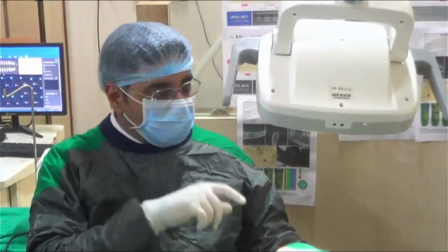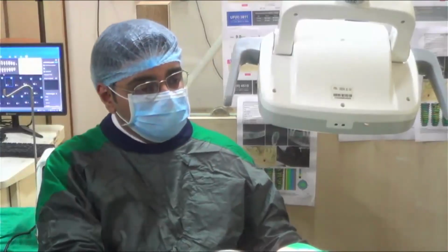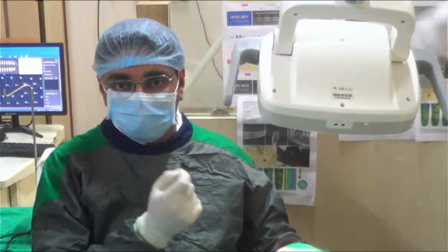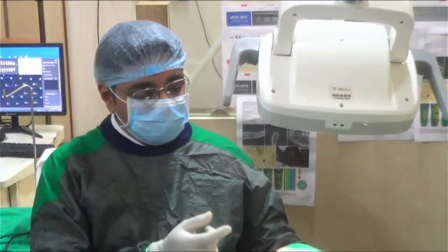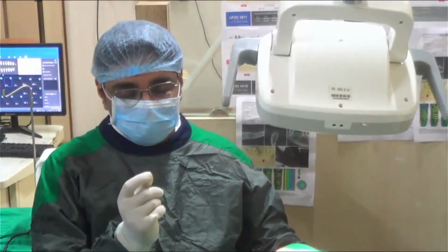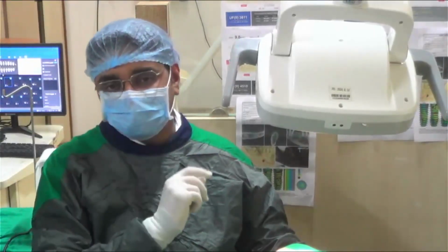So your anterior will have the screw access hole exactly in the palatal aspect, and the canine might be slightly off as well.